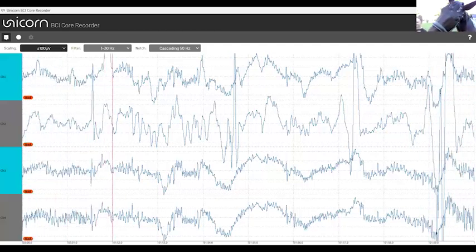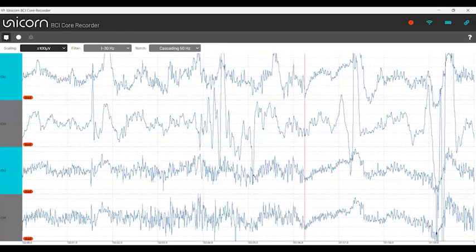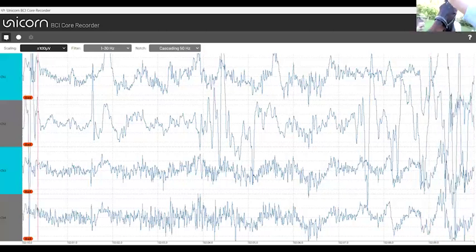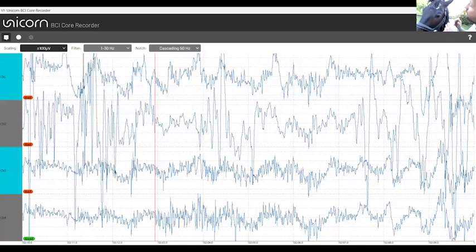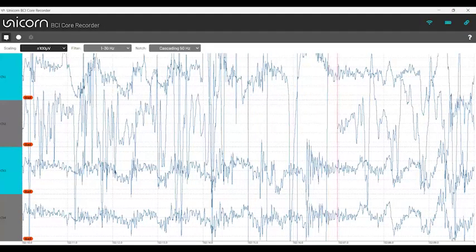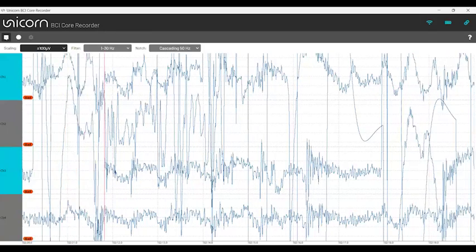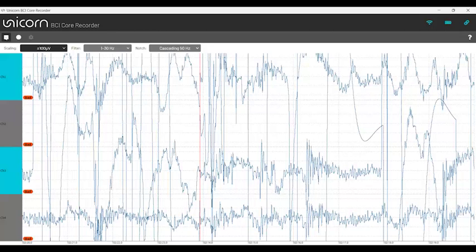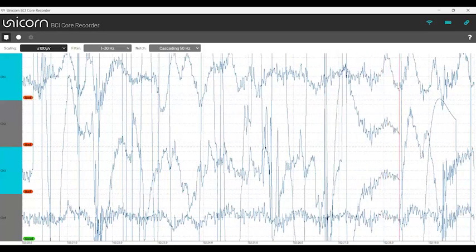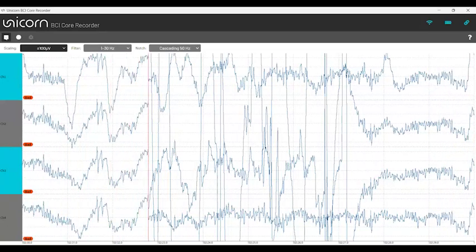Yeah, that's nice. Dream is so interested in the treats already, so I'll give him some. I have channel 2 here. Yeah, this looks like it, that's it. Now you can see that Leo lifted off the electrode, so the signal gets lost as it should. It's just floating and then picking up nonsense. So non-attached EEG channels are completely meaningless.